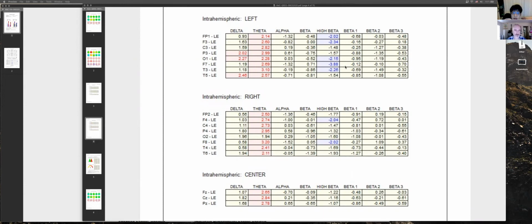Wait, do you see alpha is high in some ways? Yes, your alpha is set at a fast variant. You're built fast, but it's dragging down. But it shows a combo of negatives and positives. Yes, it's a combination because you're built fast. By default, you're a fast brain, intelligent.